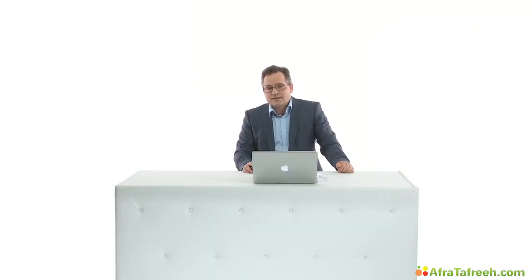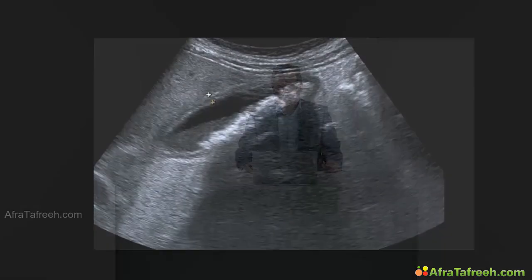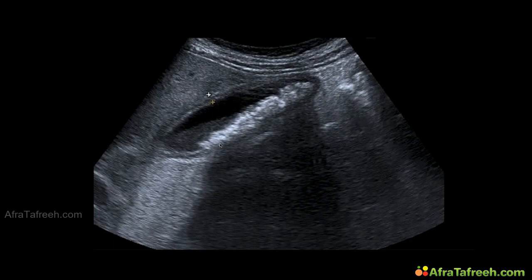You have seen these images of acute pancreatitis, but in daily clinical practice, it's not so easy to get any picture of the pancreas when there is an acute inflammation. But ultrasound is the right tool when you are looking for the causes of an acute pancreatitis or for complications. You can perform this examination at the bedside of the patient, and one does not need to transport the patient to the CT. So we can search for gallstones. I think we have already discussed this and we are almost experts on this topic.